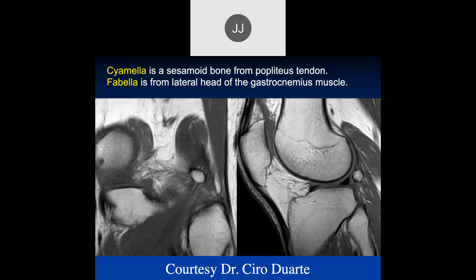The cyamella is down near the meniscus. As you can see, this is the popliteus muscle and popliteus tendon. It's more inferior and more laterally positioned. These are quite rare, but generally considered normal variants. If I do notice it, I will comment on cyamella in the report.